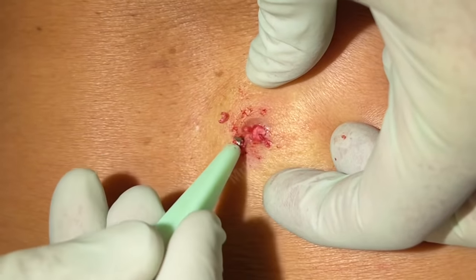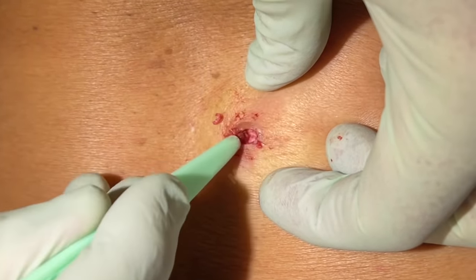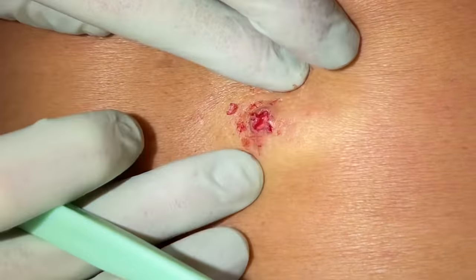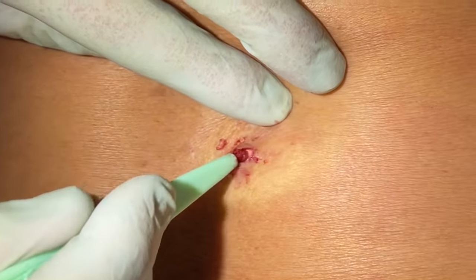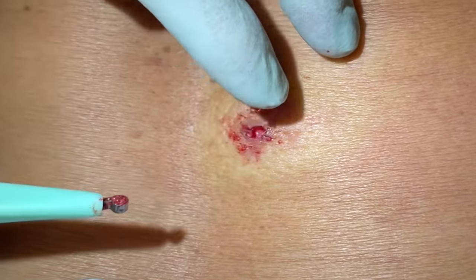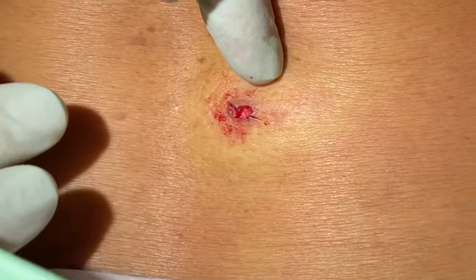Make sure it doesn't go all that deep. You know it might be worth doing just a punch. I can see it does go kind of deep and I don't want her to have a big opening there kind of leaking. So we already have her numb — I'm going to do a little punch here and just two or three little stitches and it'll close that hole for her, because the depth of that is going to be hard for it to close on its own with just cautery.